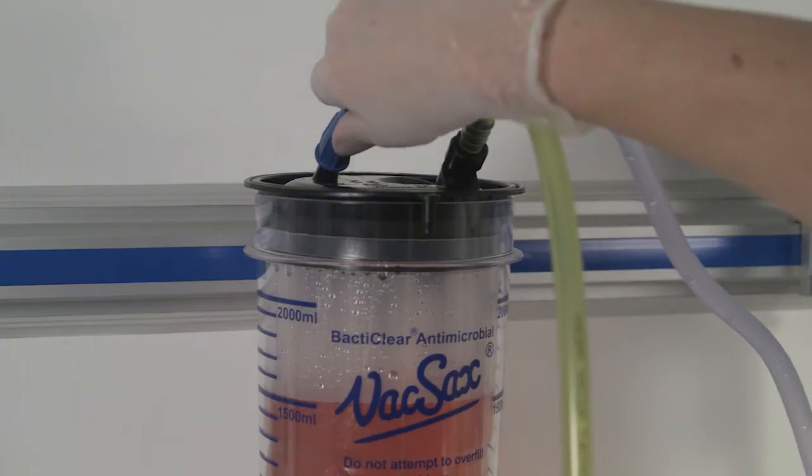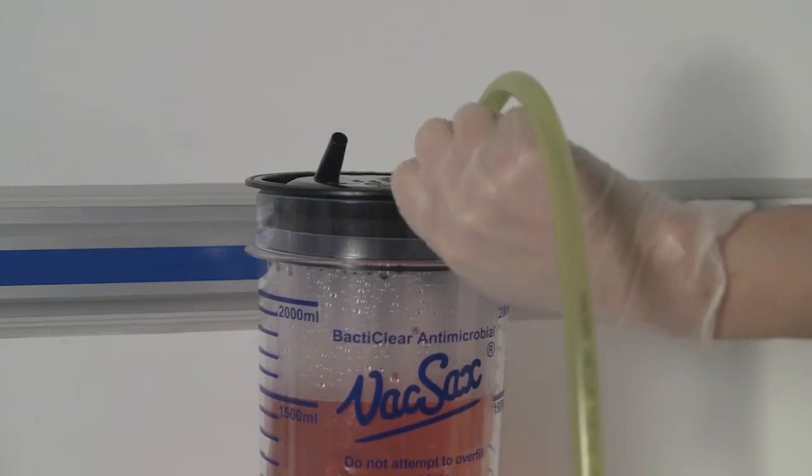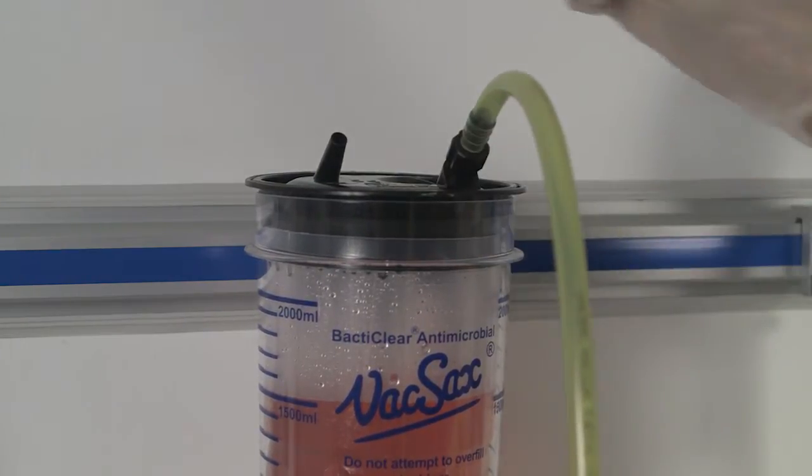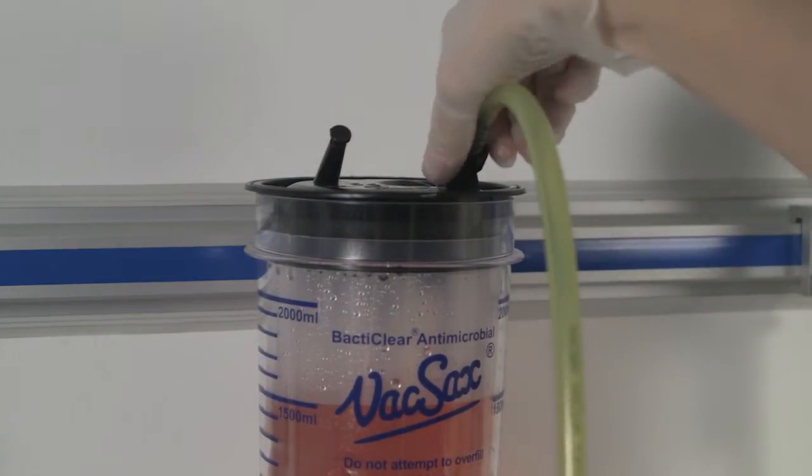When the liner is full and with the vacuum still turned on, remove the patient tubing. Twist off the black cap located on the front edge of the liner top and insert firmly into the patient port.